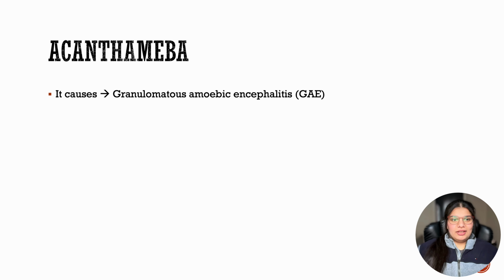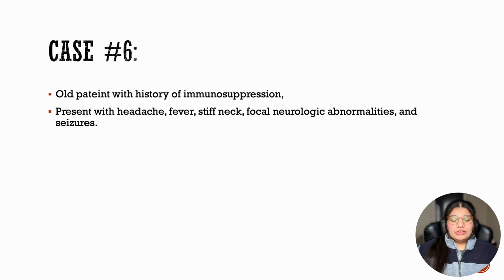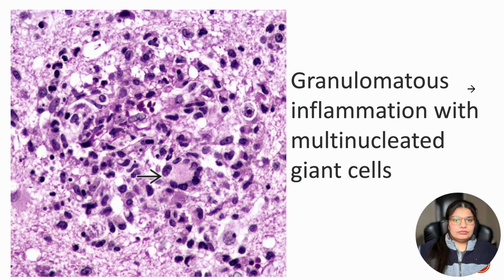Today our discussion topic would be Acanthamoeba, and what it causes: Granulomatous amebic encephalitis, GAE. We will be discussing this in detail now. Let's start with the scenario. An older patient with a history of immunosuppression presented with headache, fever, stiff neck, focal neurologic abnormalities and seizures.